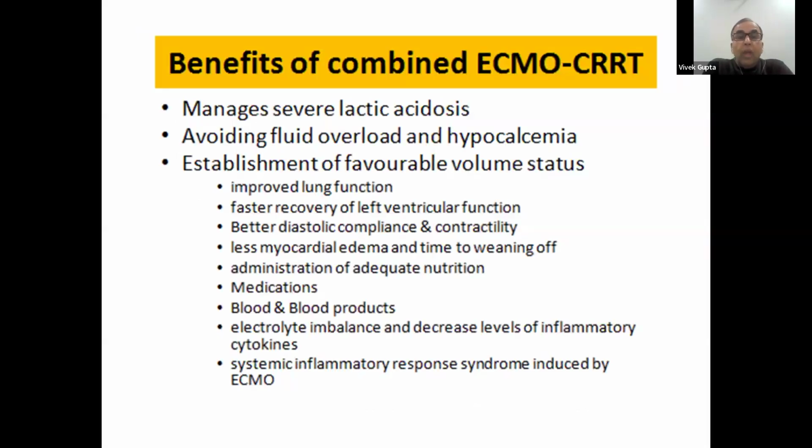Use of the renal replacement therapy. So what are the benefits of combining renal replacement therapy when a patient is on ECMO, especially when we talk about continuous renal replacement therapy? We manage the severe lactic acidosis, we avoid fluid overload and hypocalcemia, we establish a favorable volume status that improves lung function. We can use nutrition, we can administer medication liberally, blood and blood products liberally, and there are no electrolyte imbalances which can further worsen the patient's condition.